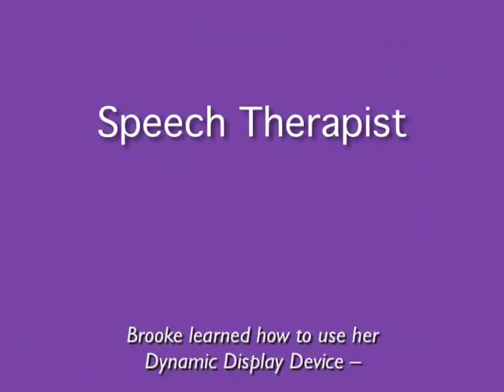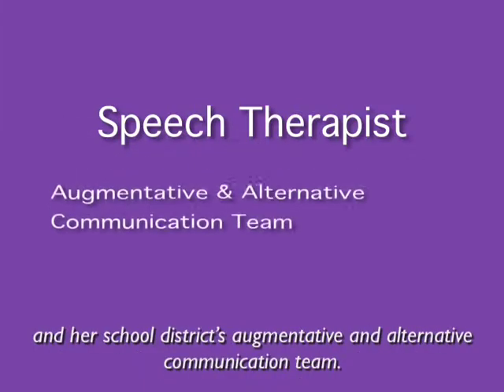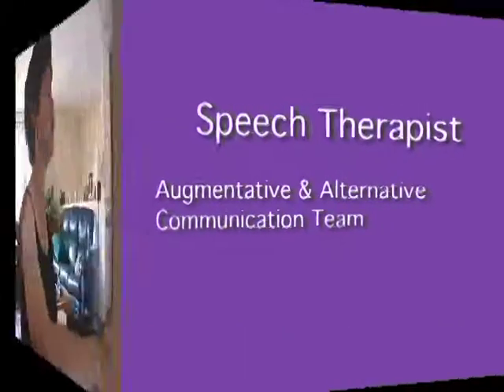Brooke learned how to use her dynamic display device at school with the help of her speech therapist and her school district's augmentative and alternative communication team.